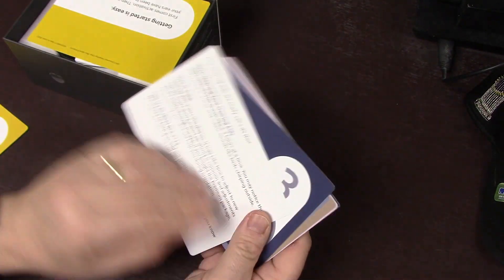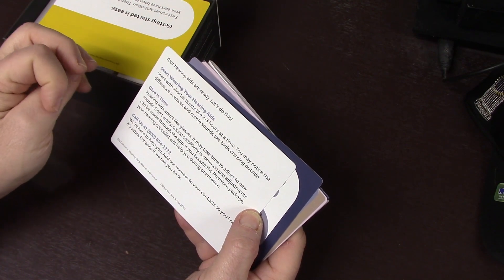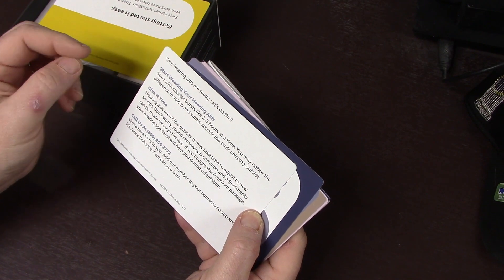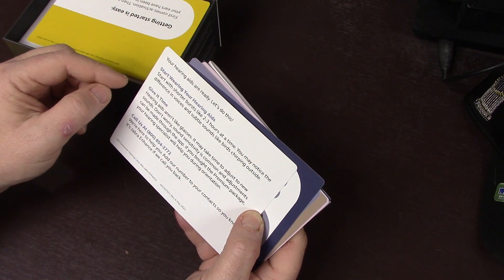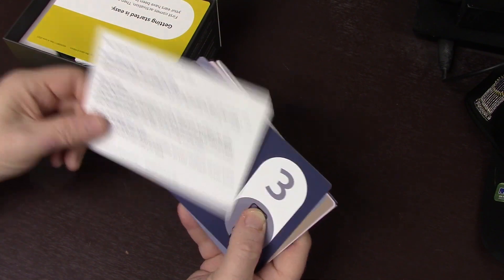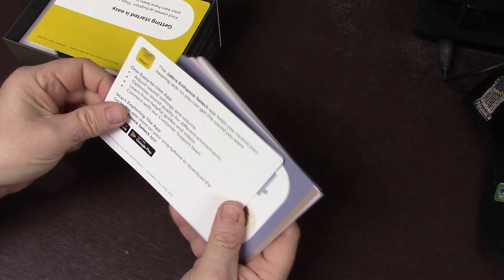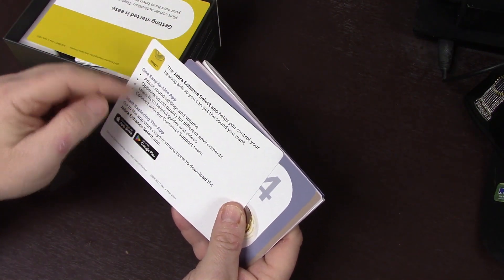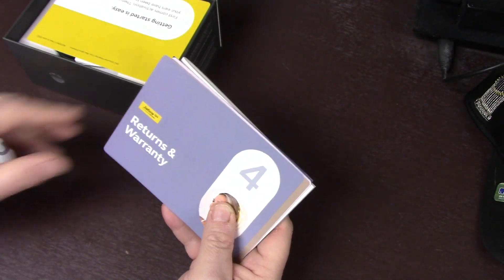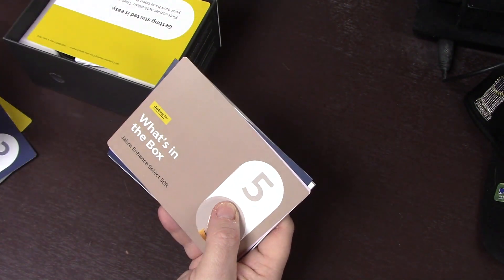What to expect: start wearing your hearing aids in shorter bursts like 2-3 hours at a time. You may notice differences in voices and subtle sounds like birds chirping outside. Give it time - hearing aids aren't like glasses, they do take some time to adjust to. The app - it does come with an app to control it through Bluetooth. And there's information on returns and warranty.